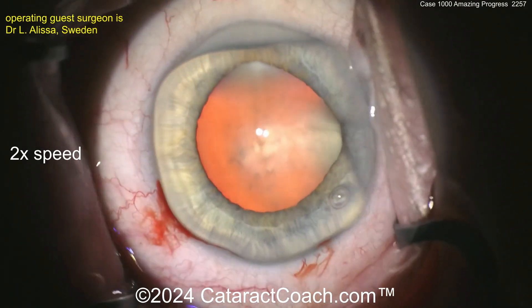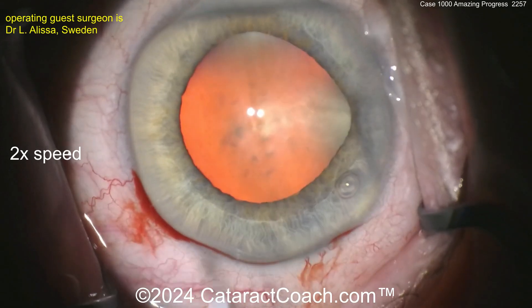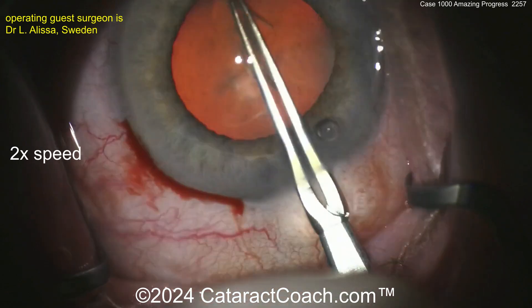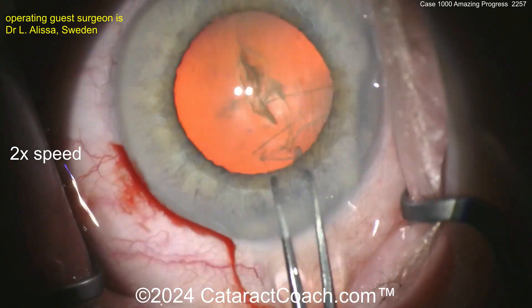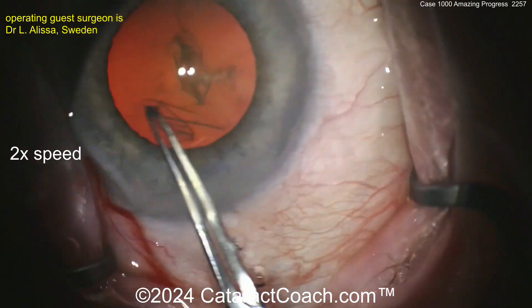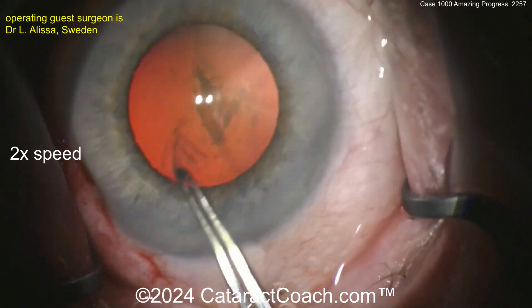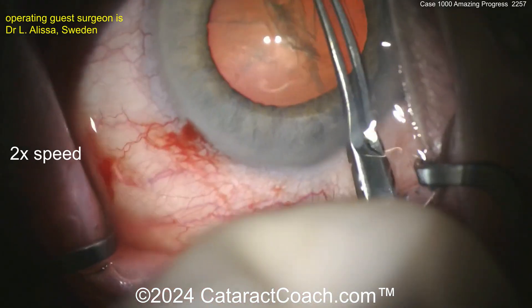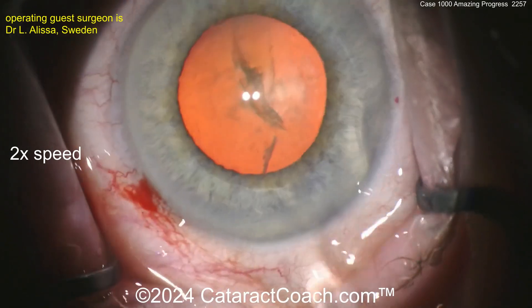What's impressive is that the surgeon has learned some great techniques. Starting off at Case 1, now at Case 1000, the rhexis is done in four steps only — a nice solid rhexis. The pupil in this case is not the biggest, maybe five to five and a half millimeters, so you want a nice generous rhexis here, and that looks pretty good.